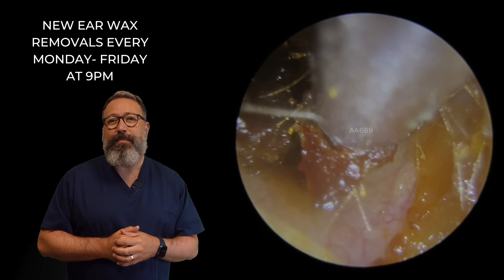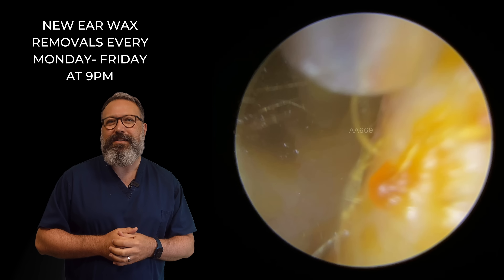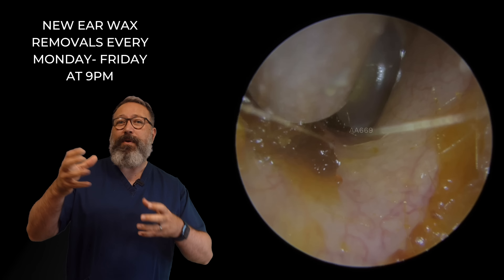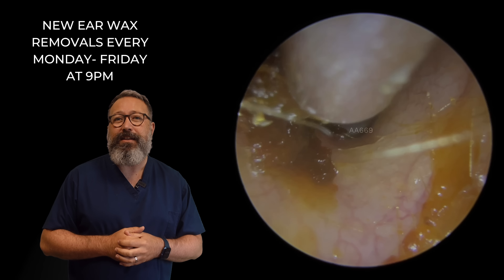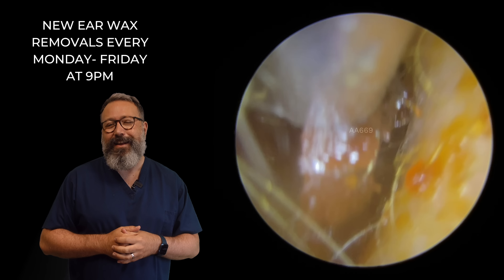So we're just picking this up. You can see it's crumbling — it's that dry. It's all just breaking away in little pieces as we take this out. And even as we're bringing the suction tube out, it's catching little pieces on the outer part of the ear canal as well. There we go. You can see those bits jumping almost off that canal there towards the suction.